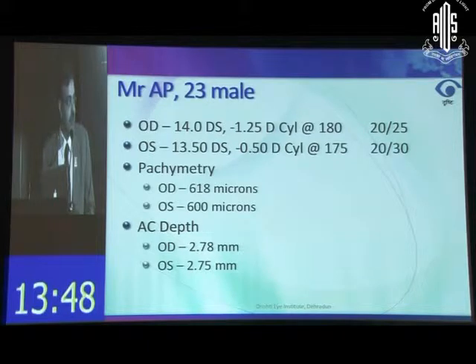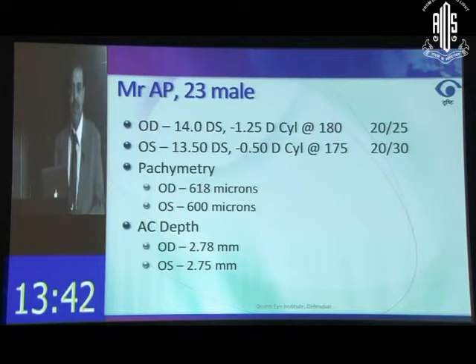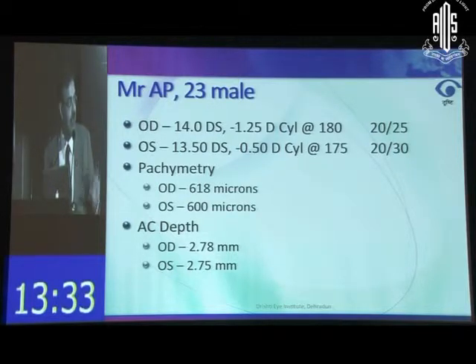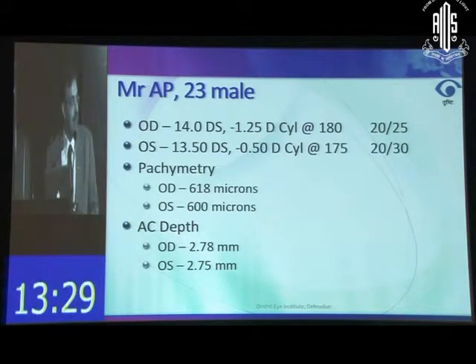Largely, I would not like to cross 130 microns. 130 microns. So, I think that's a very important message to put across, that if you are ablating, please try not to exceed 125 to 130. Dr. Ramamurthy, what cutoff do you use, like for total depth of ablation in a given patient? Even if you have like a 600 cornea here, what is the maximum ablation depth you'll do, and would you choose an optical zone which is like 5.5 today?